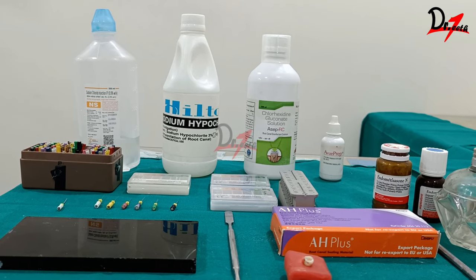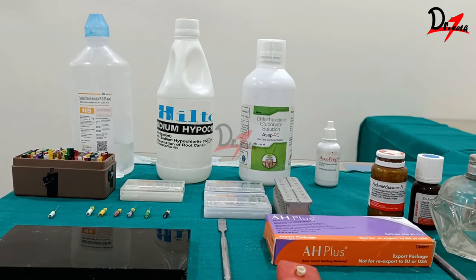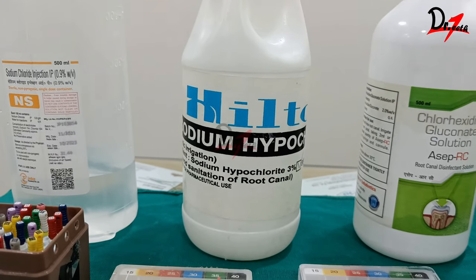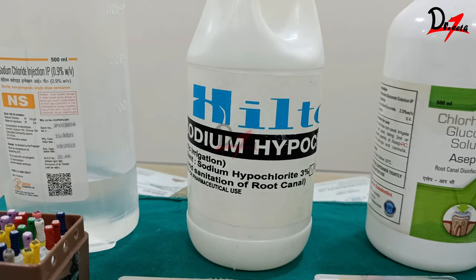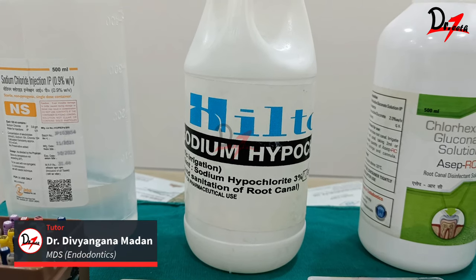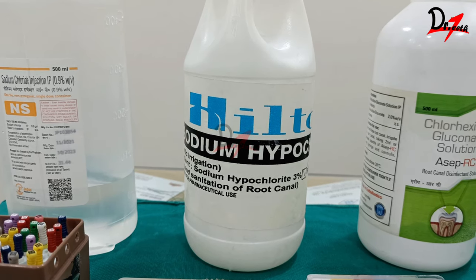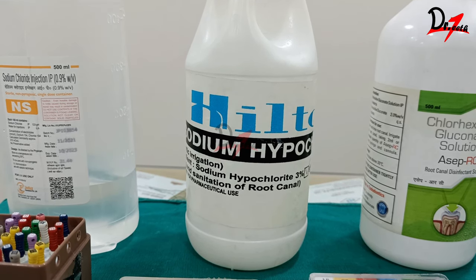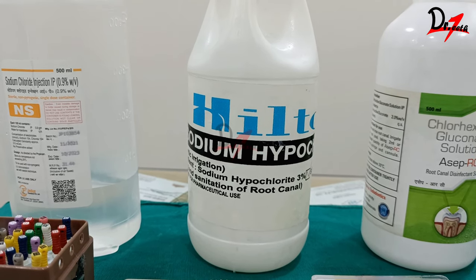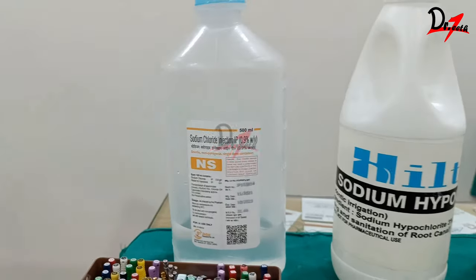In this video I'll be giving you the demo of obturation, but before obturation we need to irrigate thoroughly. For irrigation you will use sodium hypochlorite, preferably 2.5%. 2 ml exchange of irrigants is necessary between each file — so if you are going from a 15 to 20 scale file, you need at least 2 ml of irrigation with sodium hypochlorite between your biomechanical preparation.